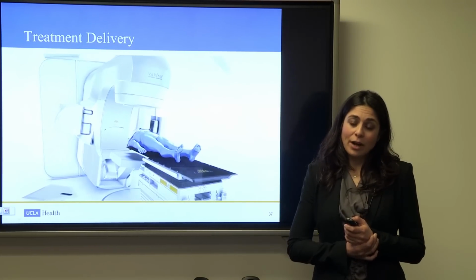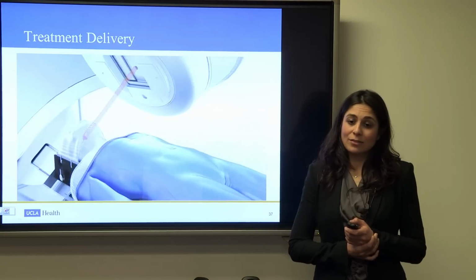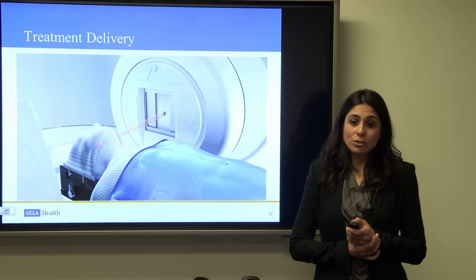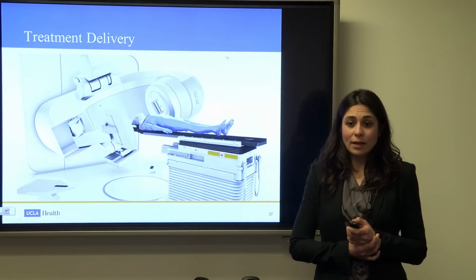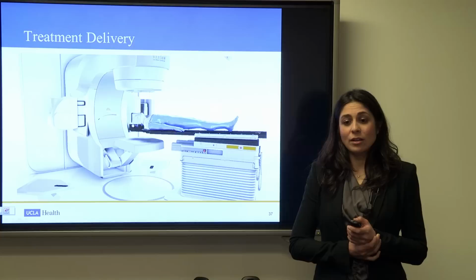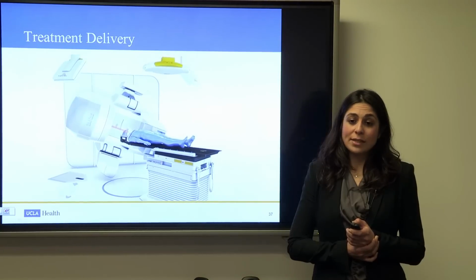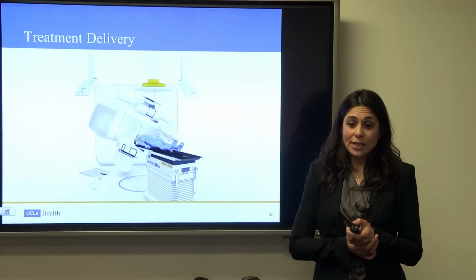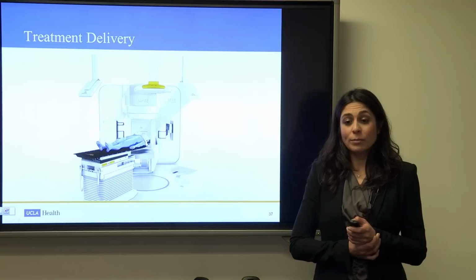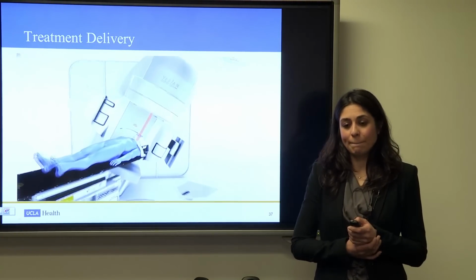And you can see here how the treatment's very focused in on the tumor region, and it delivers the dose. Each time the beam changes angles, new images have to be taken, and they have to be approved, make sure that they match perfectly, and then additional dose can be delivered. And you can see that the machine moves, but also the table that the patient is on can also move, so that we deliver the best conformal or most shape-hugging plan.